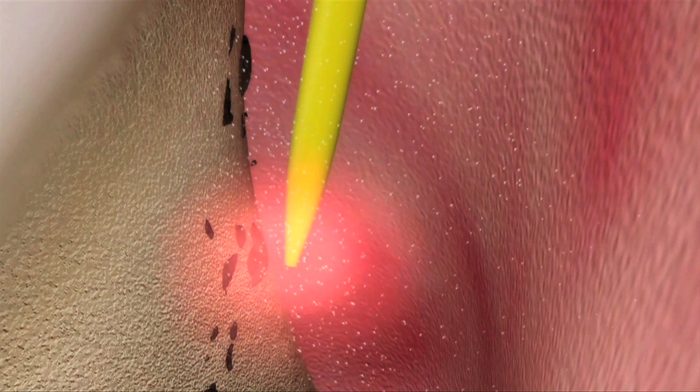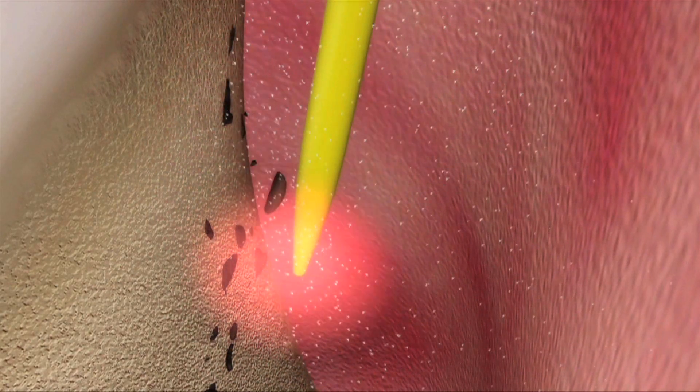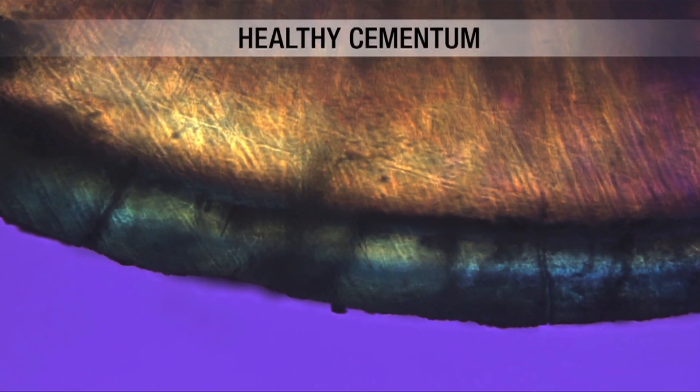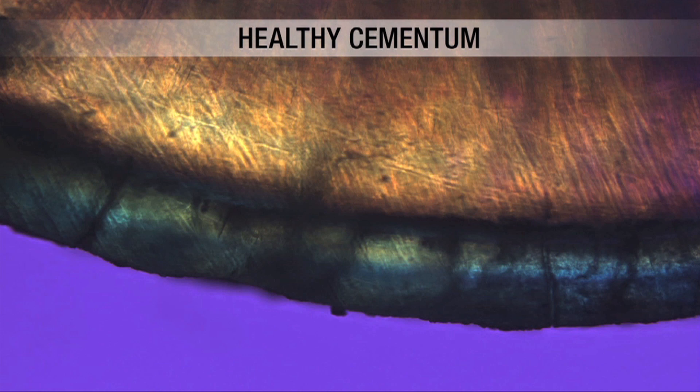Not only does this step remove calculus, it also decontaminates the root surface and removes the endotoxins that will otherwise interfere with proper healing. Finally, the Erbium YAG laser selectively removes the calculus without damaging the underlying cementum, as shown in this histology of the root surface after lasing.